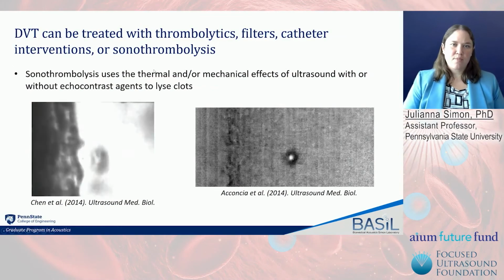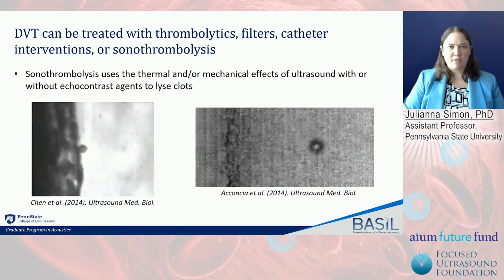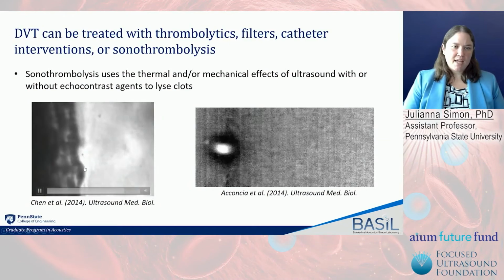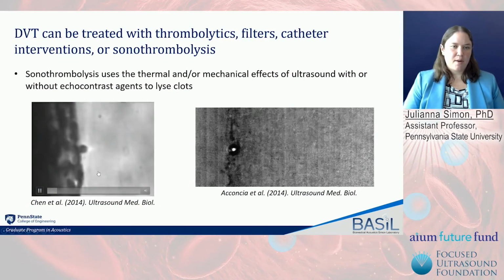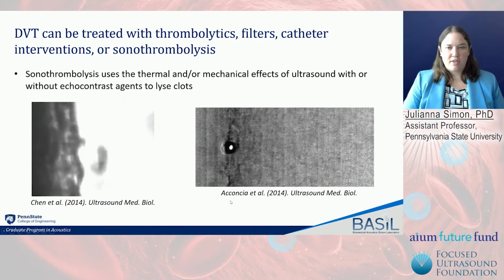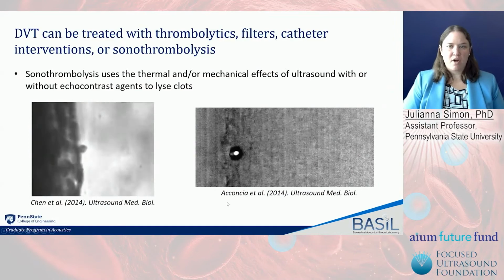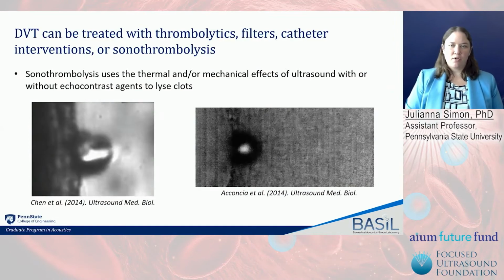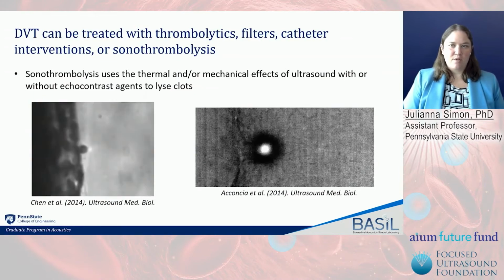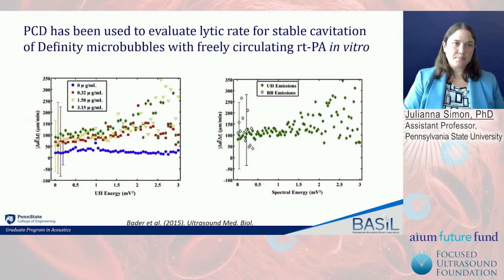Now, research has shown the thermal mechanism isn't very big in sonothrombolysis. Originally, it was thought to play a role, but evidence has shown not much of a temperature increase. Mechanical effects we see on the left, we see this bubble oscillating and causing pitting of the surface of the clot. And then on the right, we see the stable cavitation where here's the clot boundary. Basically, as this bubble oscillates, it's forming a tunnel through this fibrous clot, and that allows RTPA and other thrombolytics to help dissolve the clot.